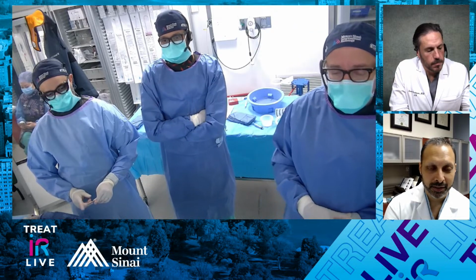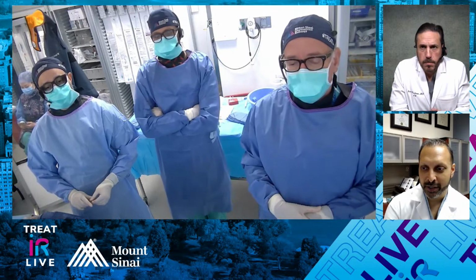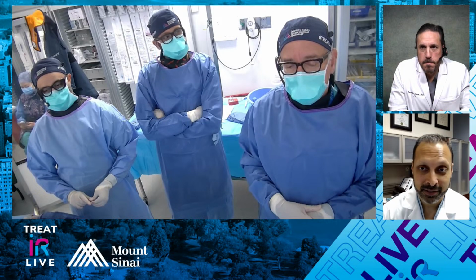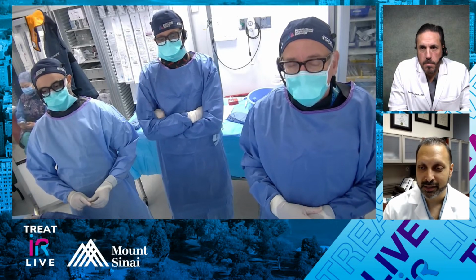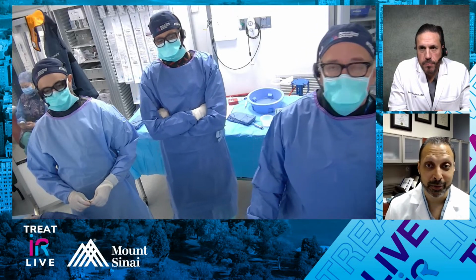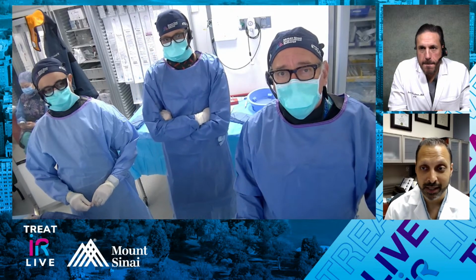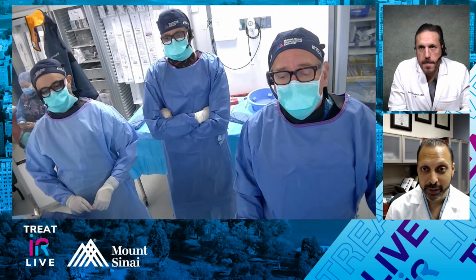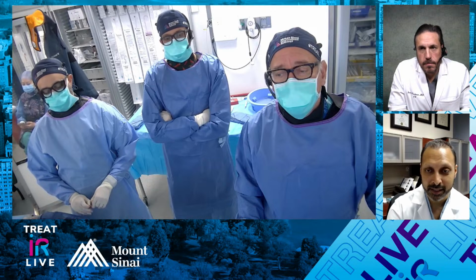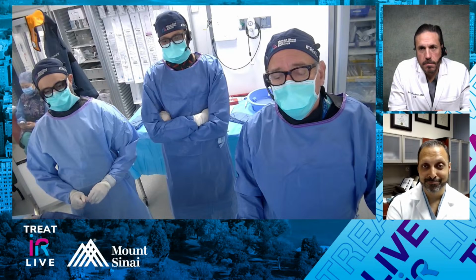Perfect. I think it's good to end on that, to at least close that out for the audience, as obviously doing the intervention exquisitely is a good thing, but following up to make sure the intervention is going well for the patient's clinical problem is just as important. You guys did a great job. I think the IVUS exquisitely shows a lot of the lesions that you wouldn't appreciate as well on angio. Being able to do this radial and using that guide catheter to select each really well, expert operators for sure. It's really, really great to see this. I enjoyed it. Thanks for having me.